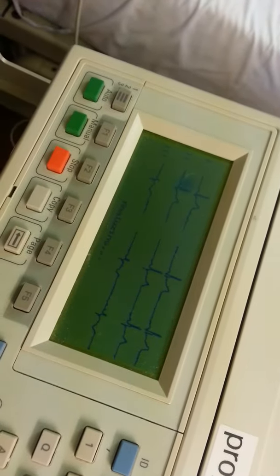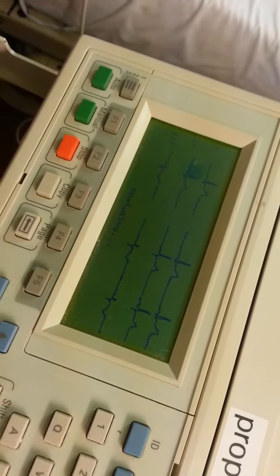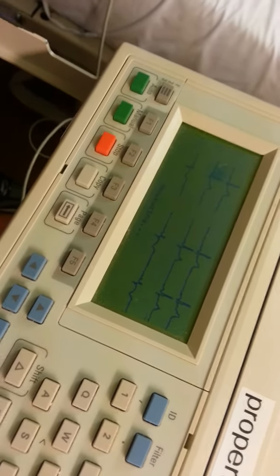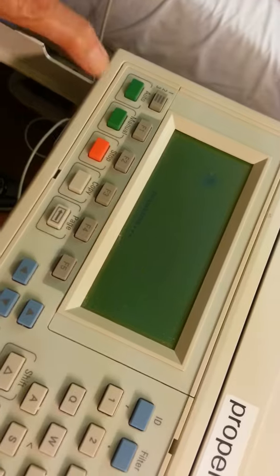It's analyzing now. It should print shortly — it's automatic, that's why it says automatic. Yes, it's coming out.